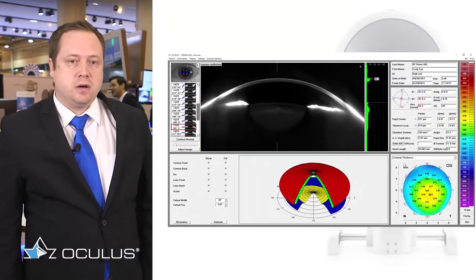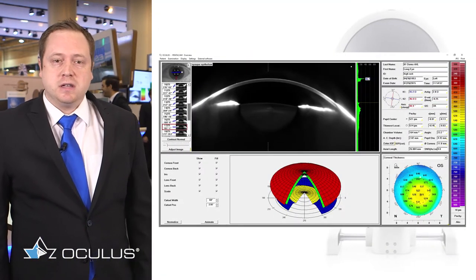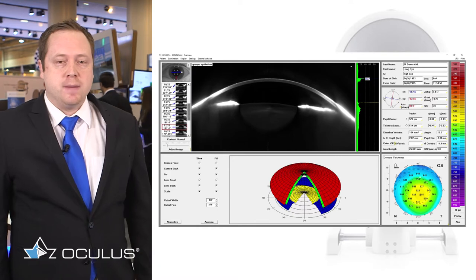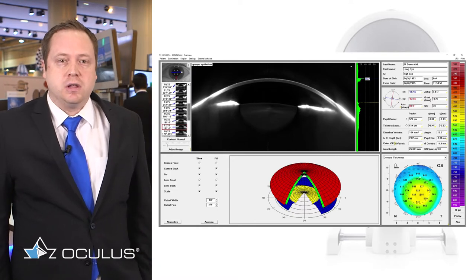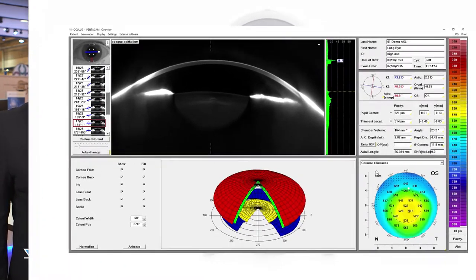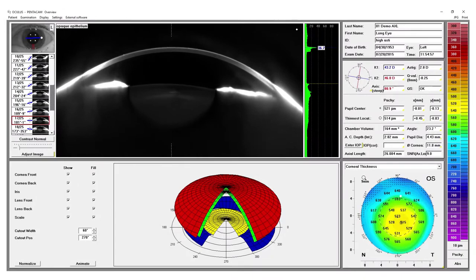With the single scan, the Pentacam AXL gives us a lot of information. It gives us the actual raw Scheimpflug images so we can qualitatively look at the anterior segment and we can actually look at 25, 50 or 100 slices of the anterior segment and really get a picture of the cornea, anterior chamber, iris, crystalline lens, the angles and everything like that.